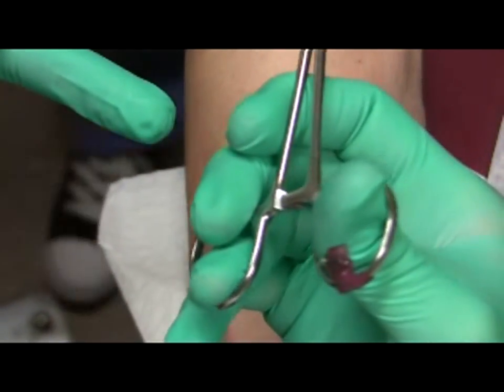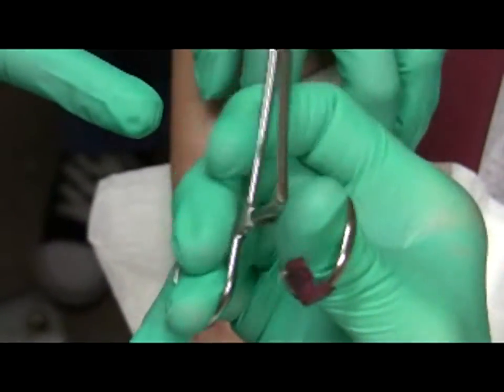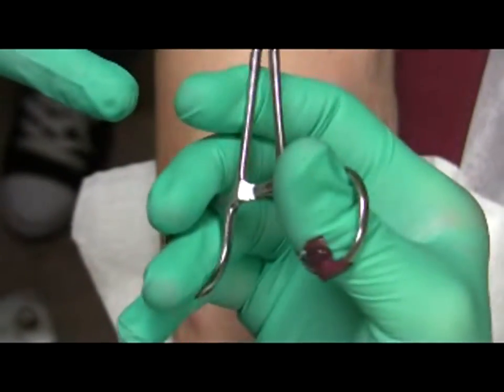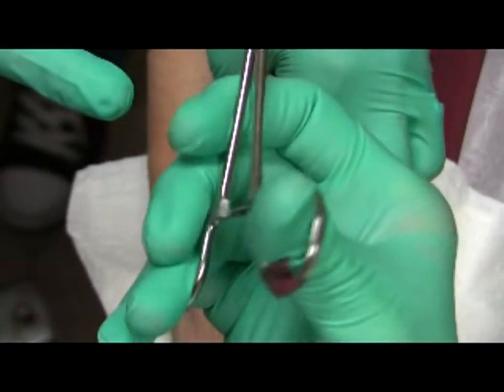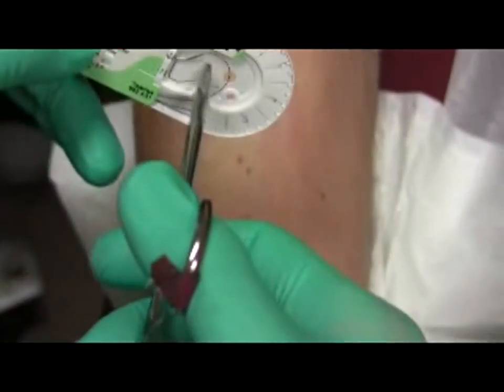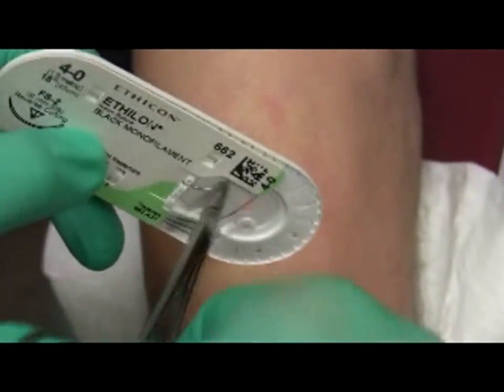I click it back down and push out and it unlocks. You don't need to push out very hard — just enough so it flips open. You can even hear it. I grab this, and now I have my needle.